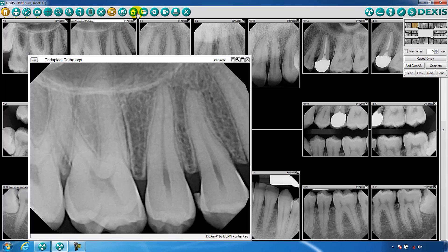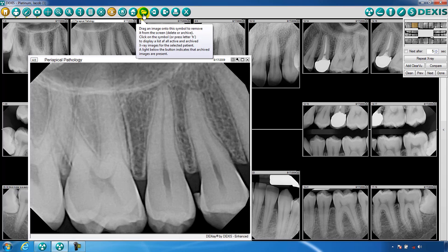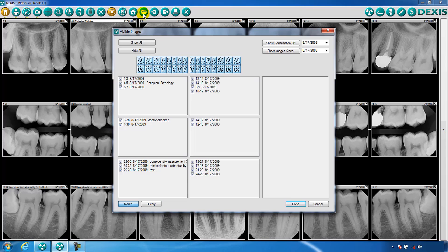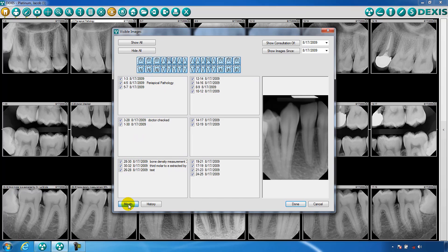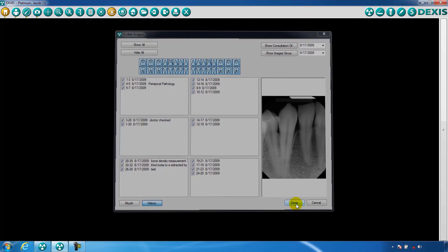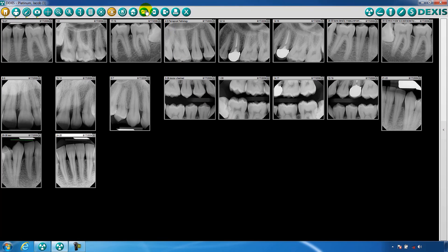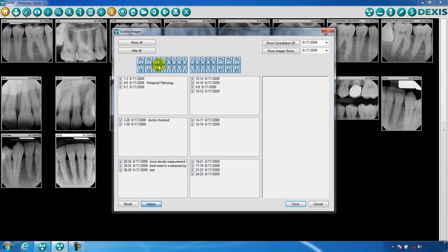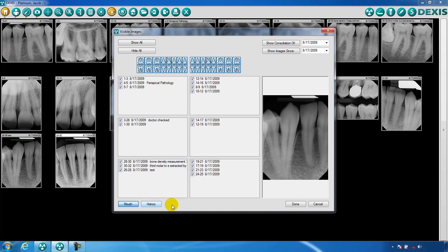Archive is the next tool. This is your patient's folder for all images. You could use this option to store images off screen and retrieve them for viewing later, as necessary. With this option, we could also switch between viewing images in a full series or in chronological, historical order.